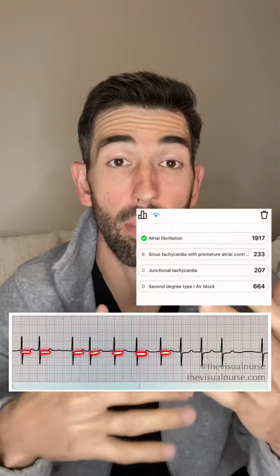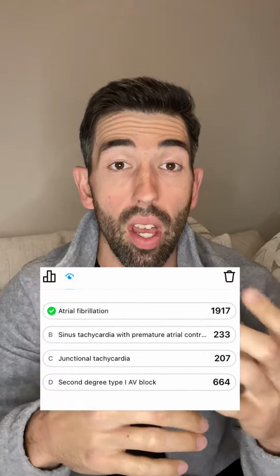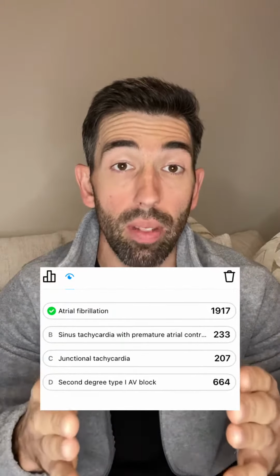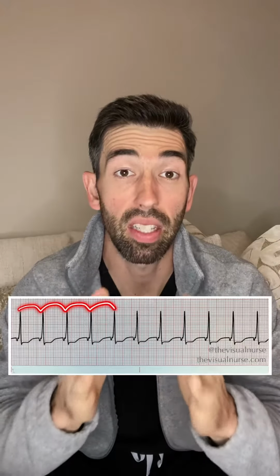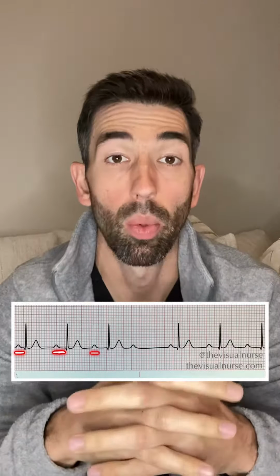Now compare this to some of the other potential responses. In sinus tachycardia with premature atrial complexes, we'd expect to see a regular underlying rhythm with isolated early beats occurring. With junctional rhythms, we typically expect these to march out routinely, since they're coming from a reliable pacemaker source in the heart. And finally, in second-degree type 1 heart blocks, we expect to see a progressive lengthening of a PR interval preceding dropped QRS complexes.